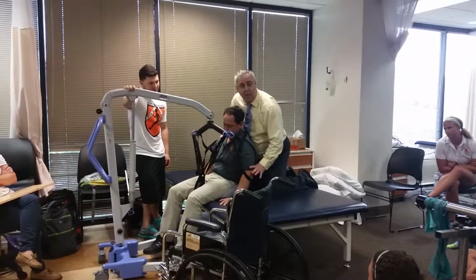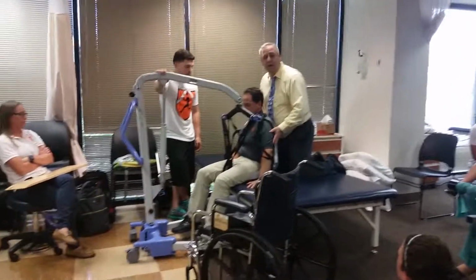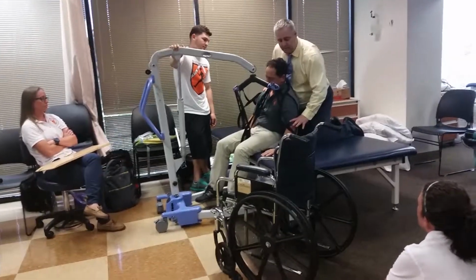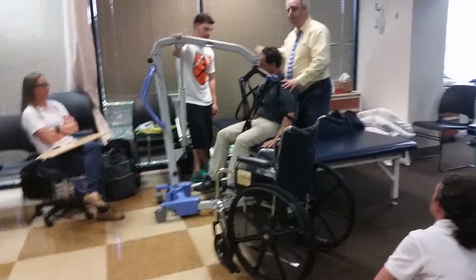So now what muscle is working? Tricep. His tricep. And I'm supporting and then I'm leaning back and give the tricep a break. I'm leaning, holding his tricep, come back, give him a break. Okay? So now we say, okay, he's done enough, so now we pump him back up. And we're going to bring him to the chair position.